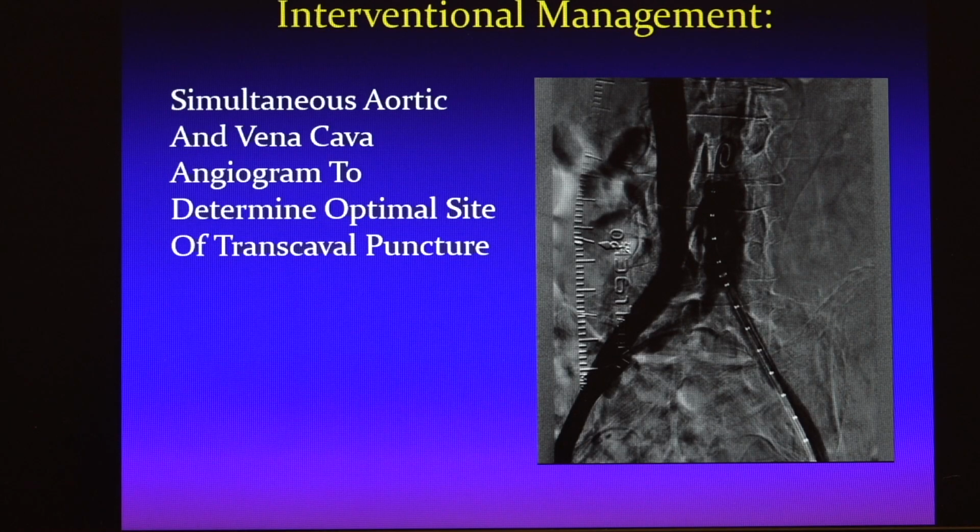After we confirm the position, we use cautery on the end of the wire and cross with that wire, and then snare the wire, and get the wire all the way to the descending aorta, and move the .014 catheter on top of that. Then we move the .035 catheter, and once we get that, we take the .014 wire and catheter out and put a stiff .035 wire.